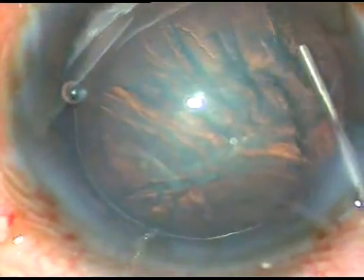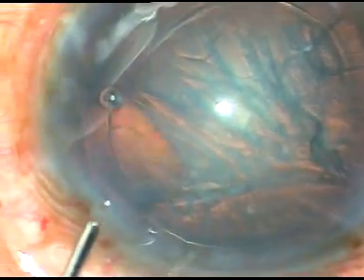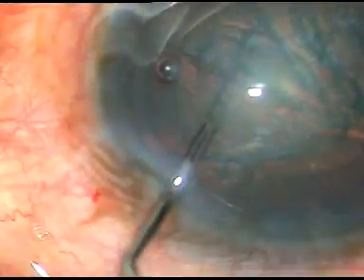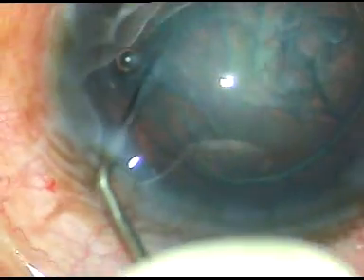Now I depress the nucleus and then I try to rotate the nucleus. Let us see if it rotates. Yes, the nucleus is rotating slowly.